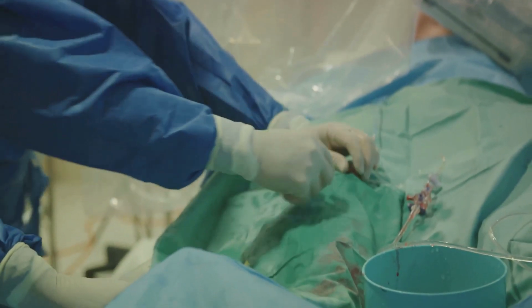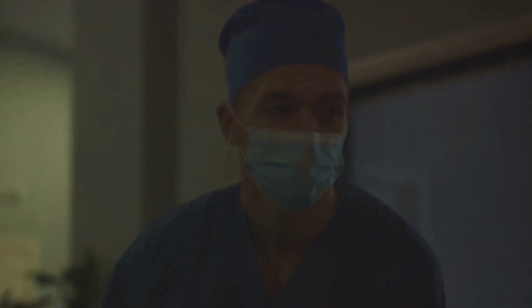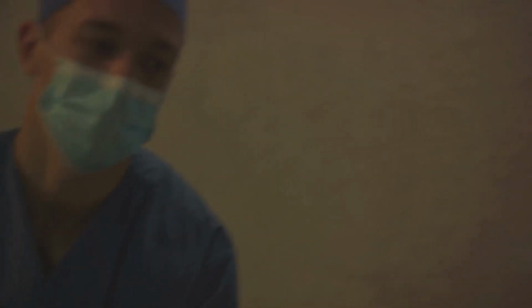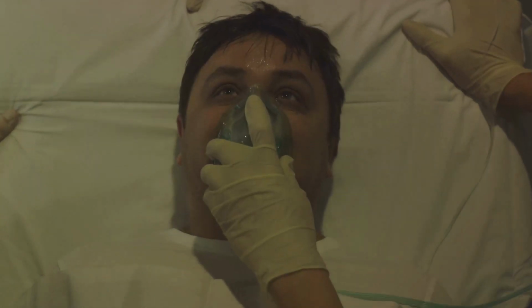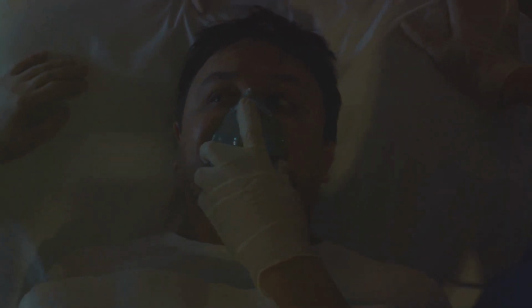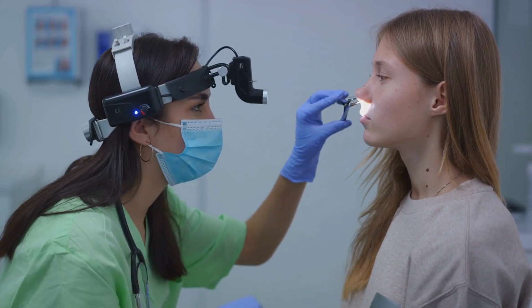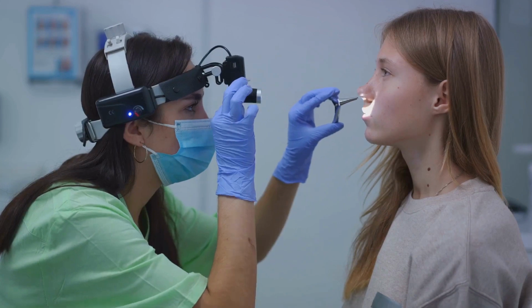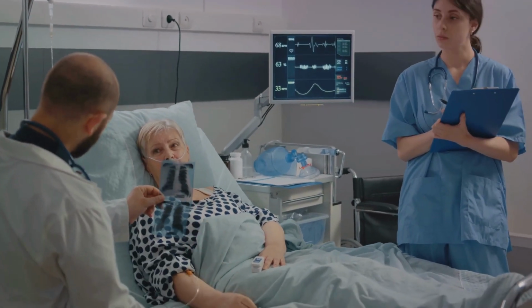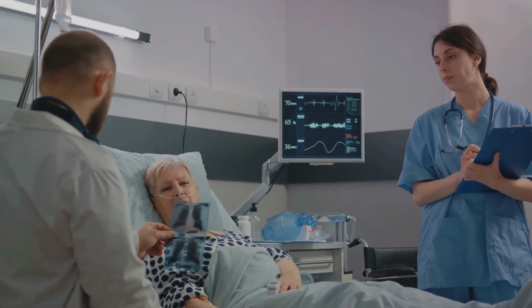The bronchoscope is then gently inserted into the nostril and advanced until the vocal cords are visualized. Once the vocal cords are in view, the bronchoscope is advanced through them and into the trachea. The nasotracheal tube is then advanced over the bronchoscope and into the trachea. The bronchoscope is then withdrawn, leaving the tube in place. Again, it's essential to confirm the correct placement of the tube. This can be done by observing chest rise and fall with ventilation, listening for bilateral breath sounds, and using the bronchoscope to visualize the carina, which is the point where the trachea divides into the two main bronchi.